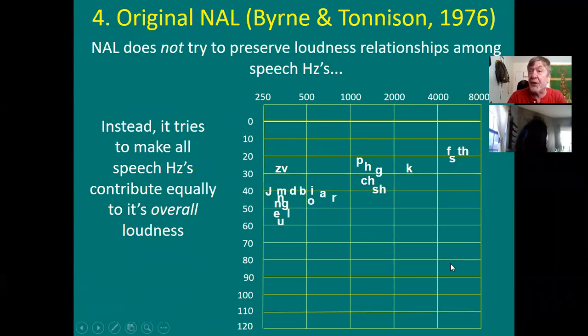Now, the last one I'm going to mention today is NAL, National Acoustics Labs. Okay, National Acoustics Labs in Australia. NAL is the fourth child. Came after Libby. Now take a look at this one.